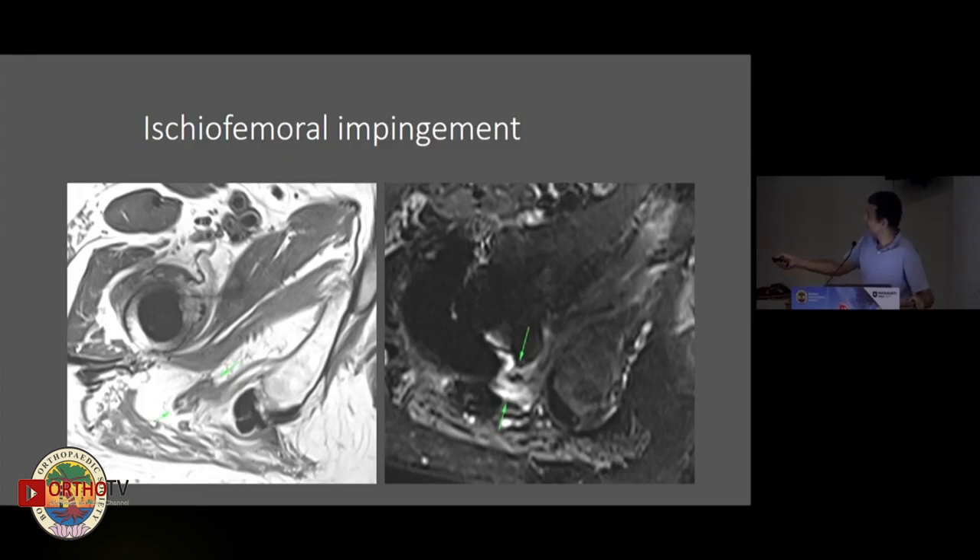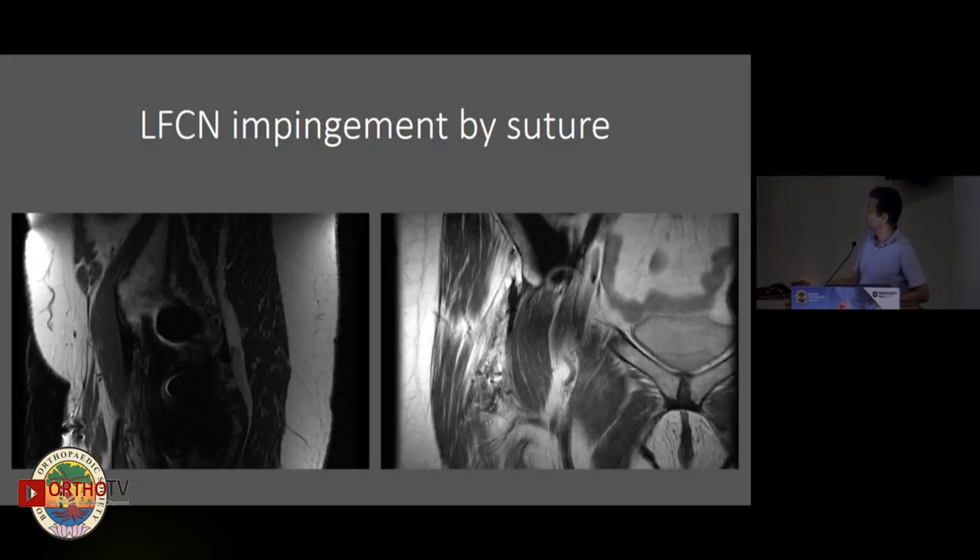Here you can see ischiofemoral impingement where the sciatic nerve is actually squashed and deformed, with high signal from what appears to be ischiofemoral bursa formation. Here's another case where suture material and debris is running along the lateral femoral cutaneous nerve in somebody with anterior thigh pain postoperatively.